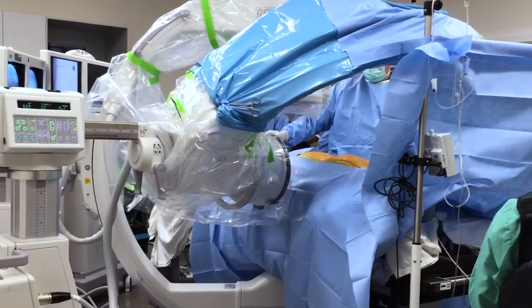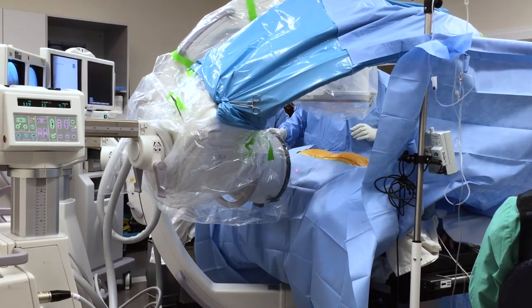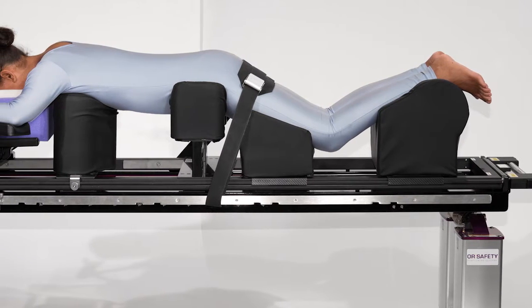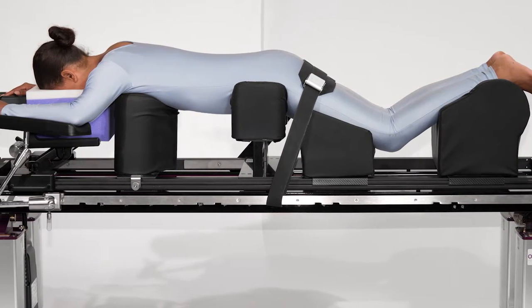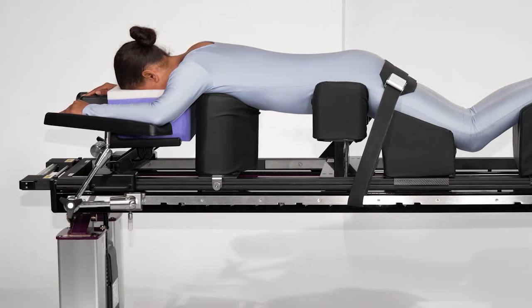The table can support the simultaneous use of two C-arms. While maintaining such unrestricted C-arm access and providing target-site radiolucency, the Clear Access Table has a safe working load of 600 pounds and has a noticeably more stable operating surface, particularly for heavier patients.